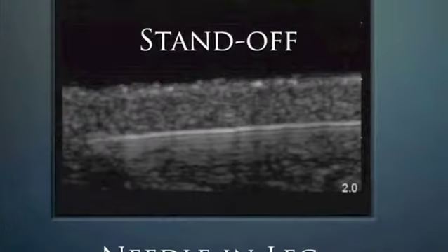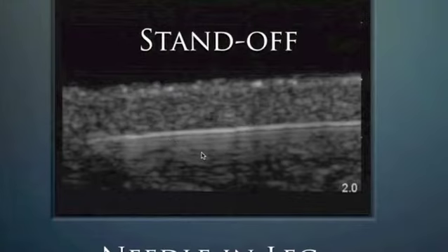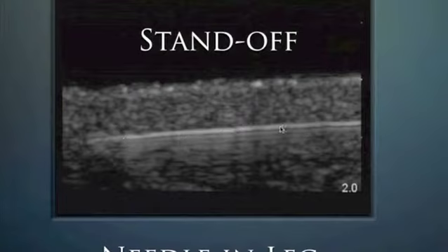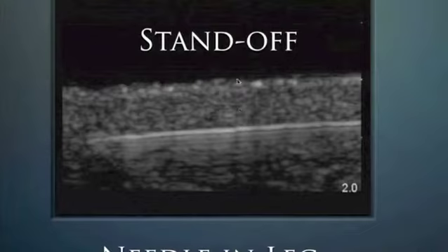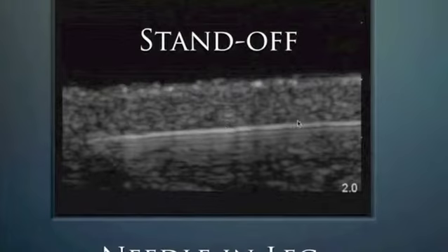Here's a needle that was in someone's leg. It clearly shows the reverberation artifact — equidistant lines toward the bottom of the screen. By ultrasound we can determine this is the long axis of the needle and the exact plane of tissue it occupies, which is very superficial. Using 0.5 cm hash marks, this needle was about 4 mm below the skin line with a standoff pad being used — confirming the needle's exact position beneath the skin.